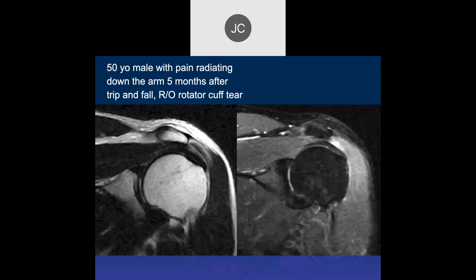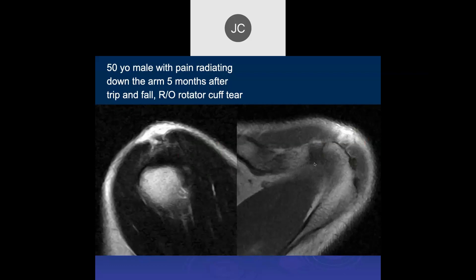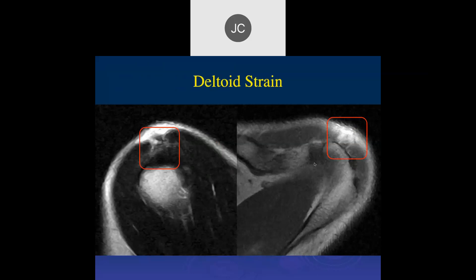A 50-year-old male with pain radiating down the arm for five months after a trip and fall, rule out rotator cuff tear. The supraspinatus looks pretty good, but there is some adjacent high signal on PD fat sat imaging — probably the subacromial subdeltoid bursa. On sagittal images, the edema is in the deltoid — so that's a deltoid strain. The deltoid is not abnormal except for fat replacement in a lot of people, but it is important to always look at it because when you see pathology in it you don't want to miss it.